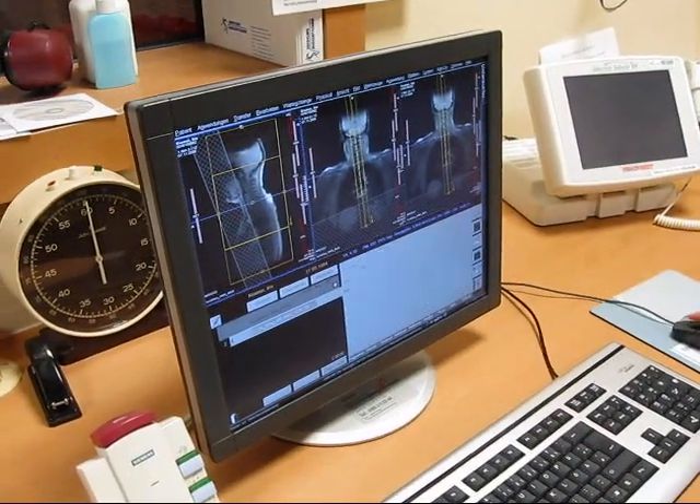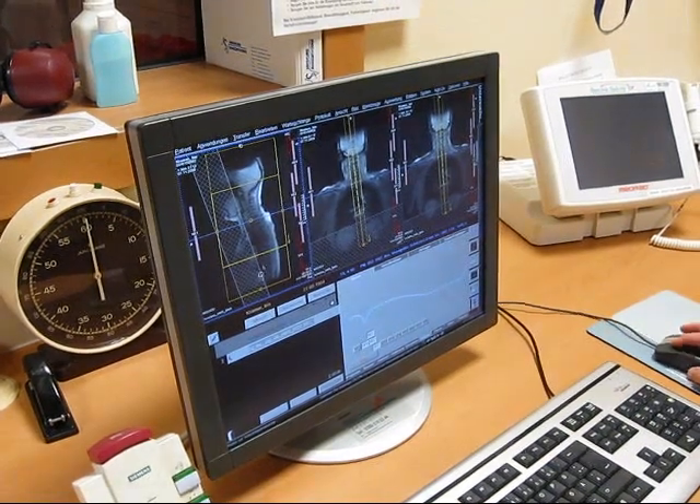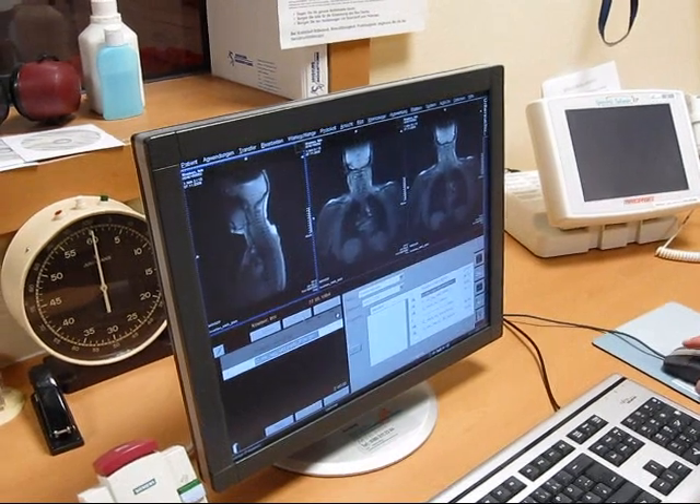This is the examiner's control room. She just did a very short overview scan. Now she will mark the area that has to be examined exactly.